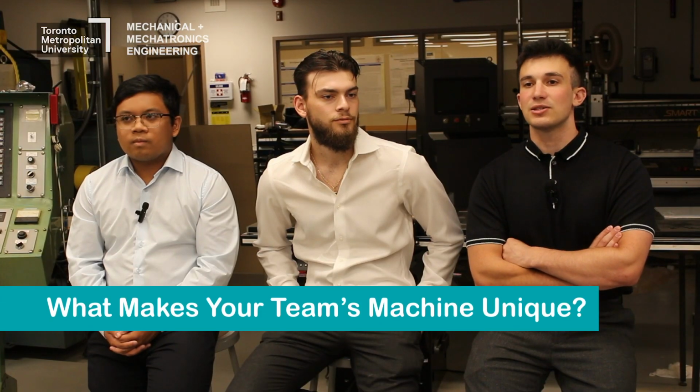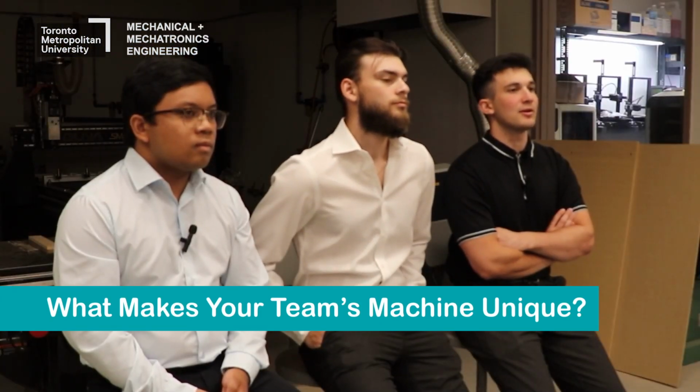Devices like this kind of exist already. They're used in hospitals all the time for patients with these kinds of hand problems. But the big issue with them is, one, they're huge, they're too clunky, and they're insanely expensive. They're somewhere in the range of millions. So usually a hospital will just have one of these devices, which is not that great.